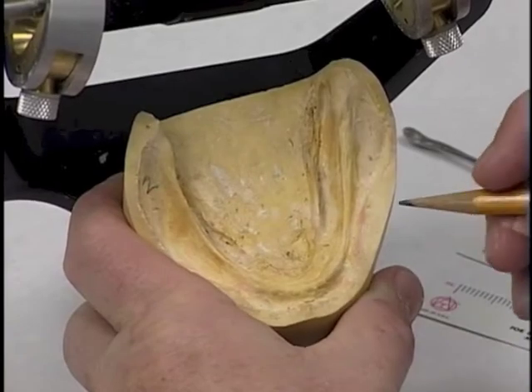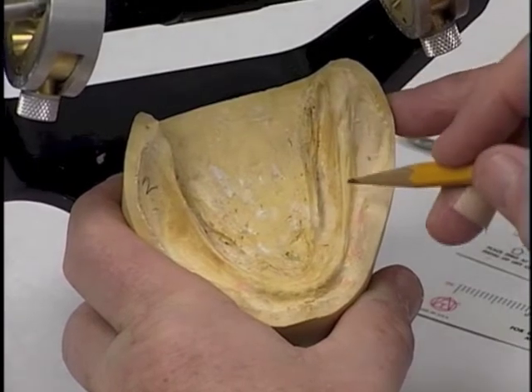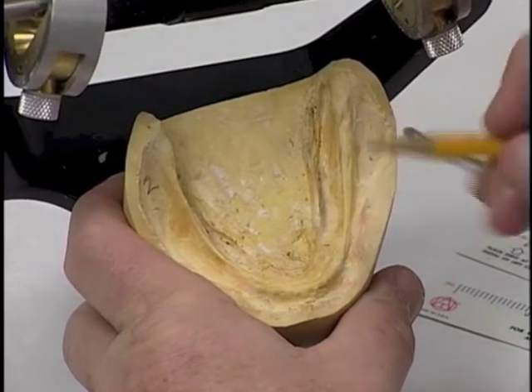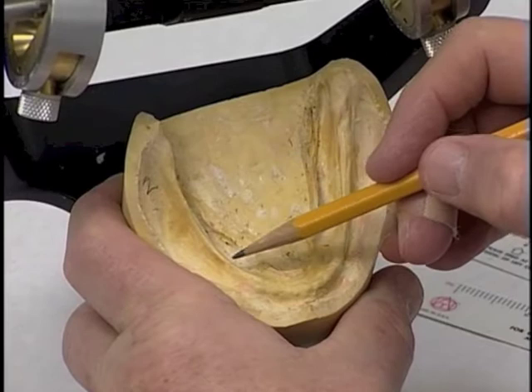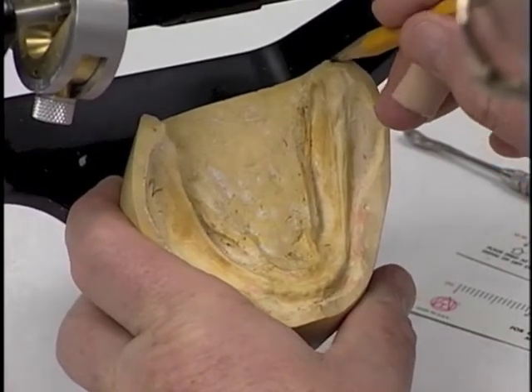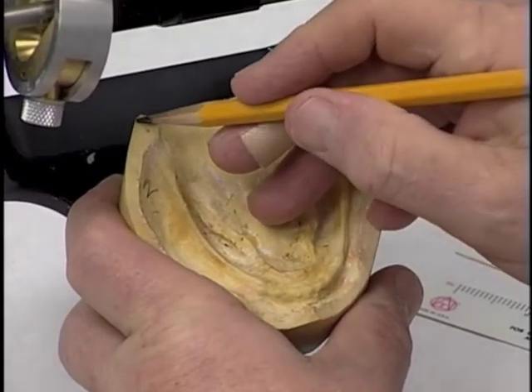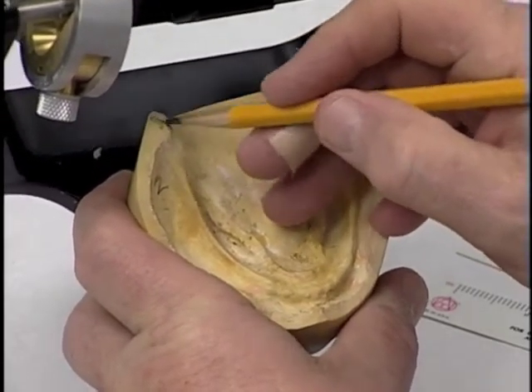In starting the arrangement of posterior teeth, it's important that we know where the crest of the ridge of the mandibular arch is on both sides. So an easy way of starting that is just to put a mark on the cast back on the heel, behind the retromolar pad, where the center of the ridge would be.